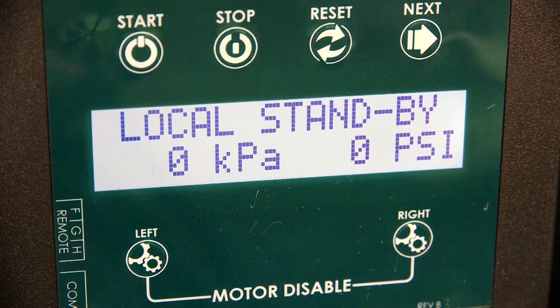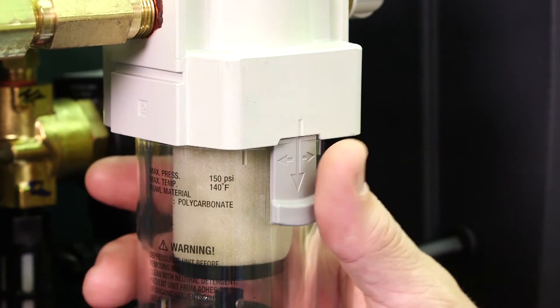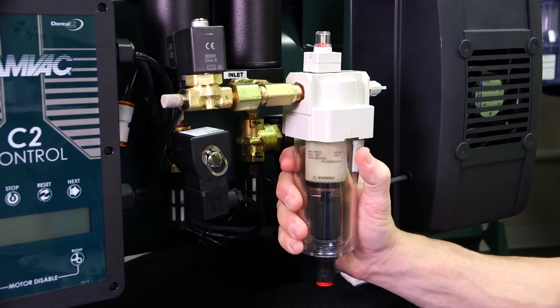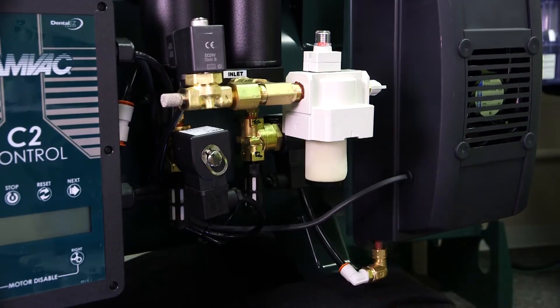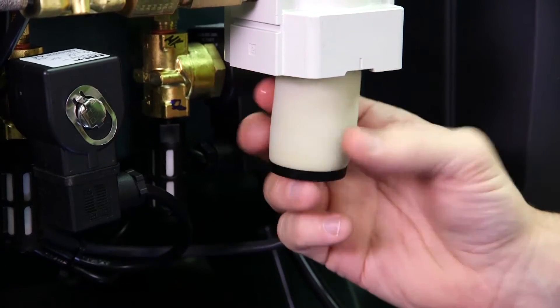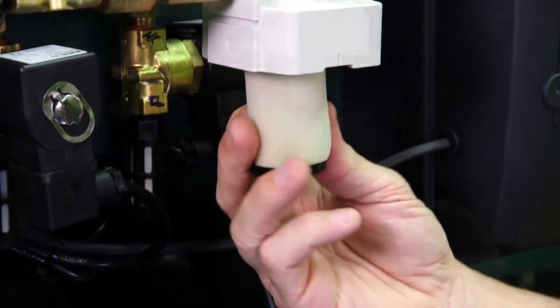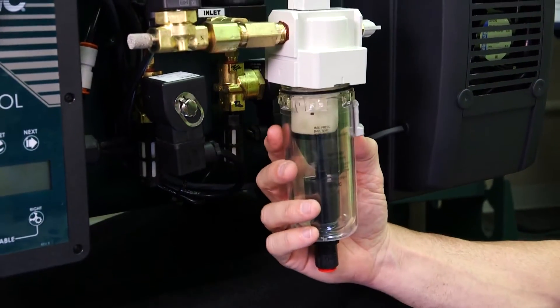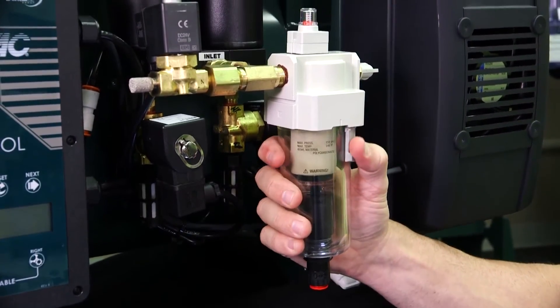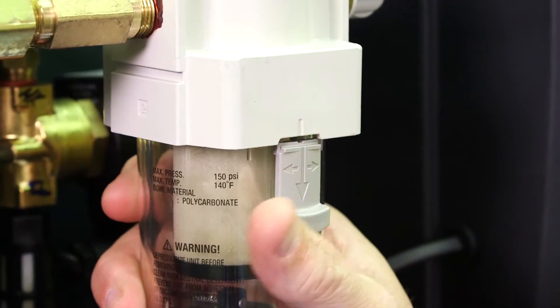Next, unplug the compressor to remove power. Third, hold the tab down and turn the coalescing filter bolt slightly right and remove. Fourth, remove the filter by turning completely out. The fifth step is to install a new coalescing micron filter. Then position the filter bowl, push up slightly, and turn left into place. The tab will snap down when the correct position is reached.